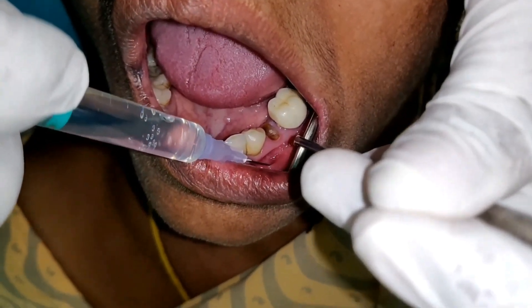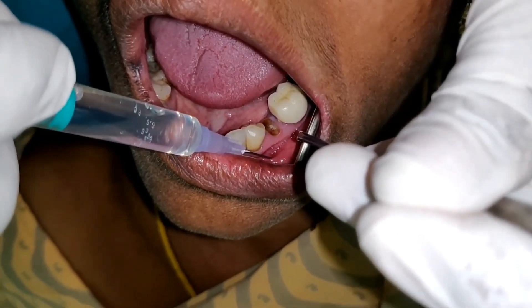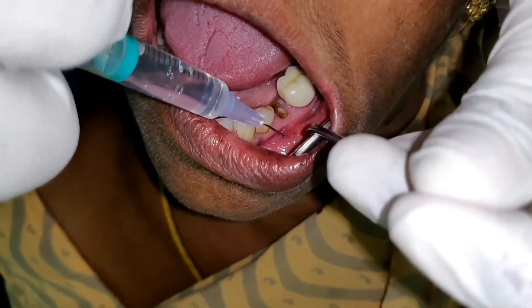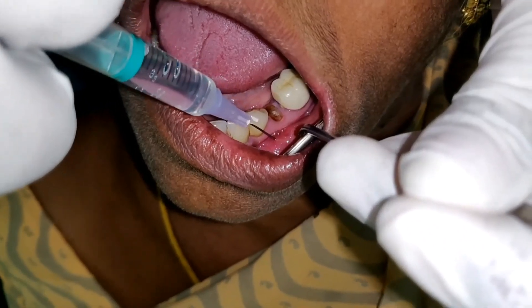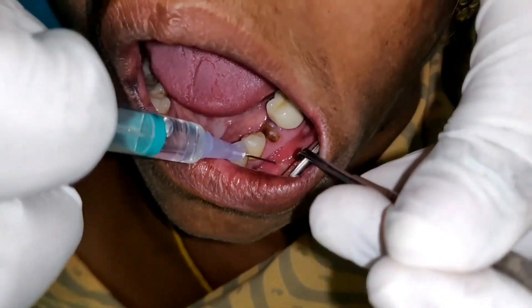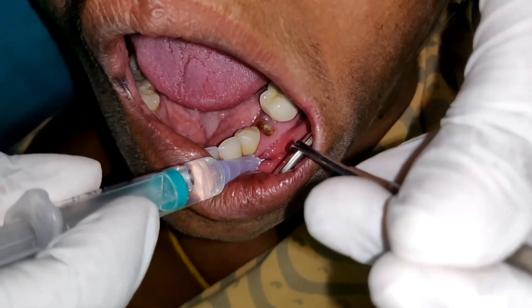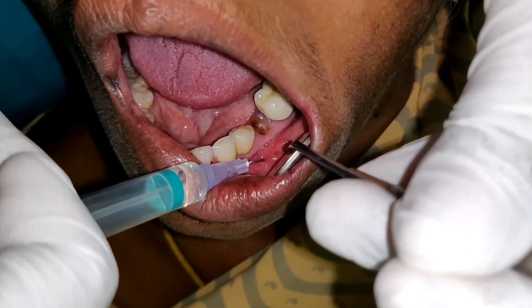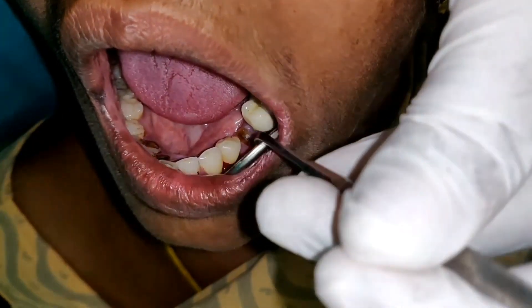For mental nerve block you usually need to deposit around 1 to 1.5 ml of local anesthesia, depending upon the infection of the site. Mental nerve block has a very high success rate, so I want every clinician to practice it as much as you can before you perfect it. Thank you everyone for watching this video.